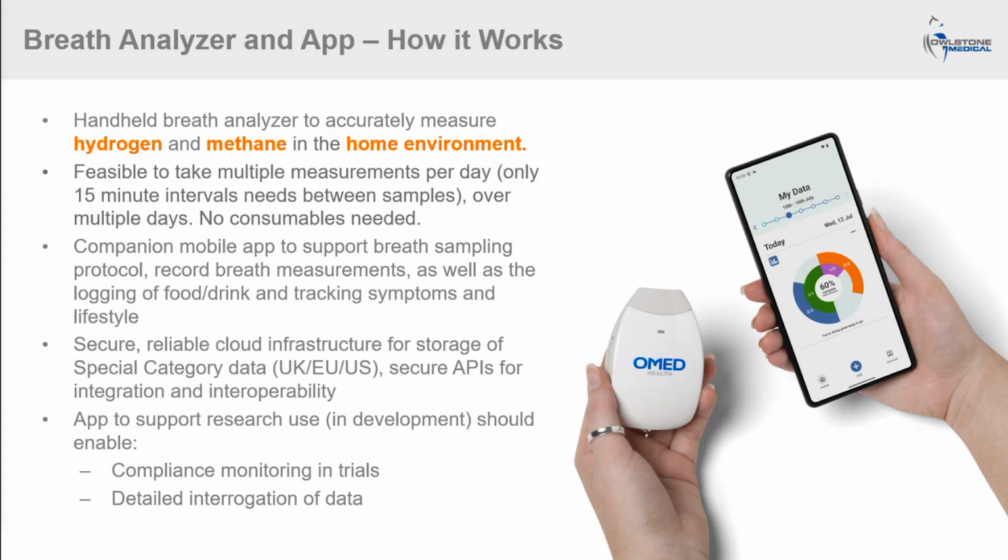What we're envisioning this research use app and portal should allow us to do is things like compliance monitoring in trials. So you'll be able to see in real time whether patients are actually taking samples or not. It should also allow you to do a detailed interrogation of the data you're collecting at the end of the project as well.